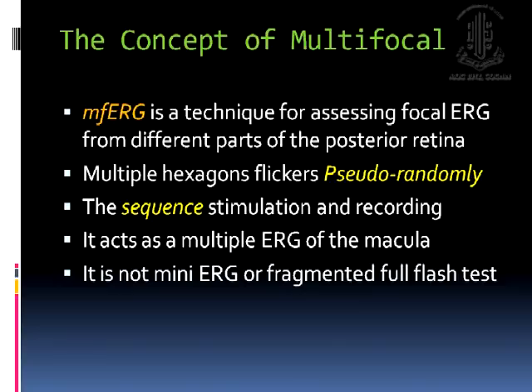Multifocal ERG: the concept is that it is a technique that produces focal ERGs from the retina in order to get more localized information from the retinal response. Instead of, as the doctor explained before, the full field ERG bringing only one single waveform summed up from the entire retina as a single response, in the multifocal ERG we get more than one response according to the degrees tested.